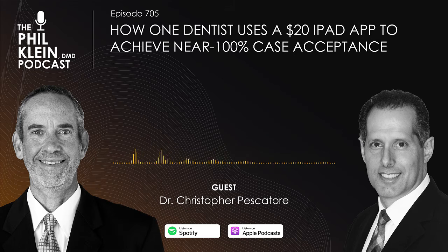When you do this, do you ever change your mind and say, hey, I don't think we can go this way? Every time I do a case, I say, oh, there's something here I might have missed, or, oh, look at this. And one of the great things about doing it this way, and just over my 35 plus years of bonding porcelain to teeth, is that you know certain areas of certain teeth require a little different preparation for functional reasons. So I built that into the library, but I also built that into how I digitally prep the simulation, because I know these certain areas need to be covered with porcelain versus I know this is a possible interference. So I can automatically do that.